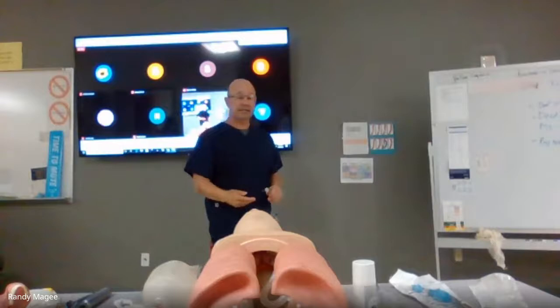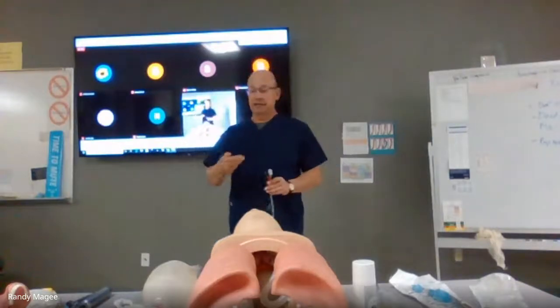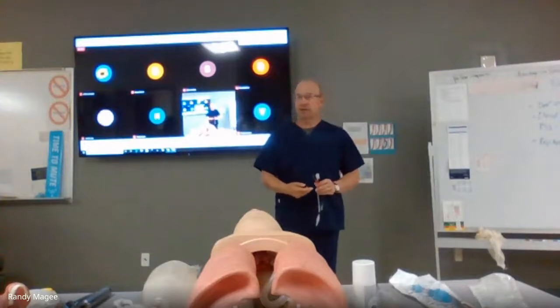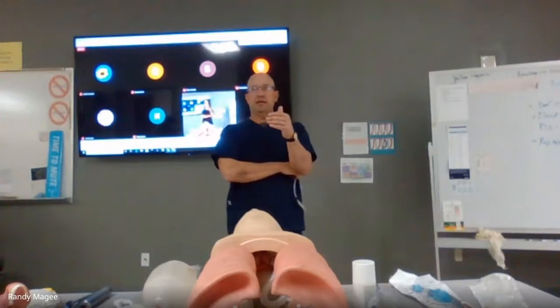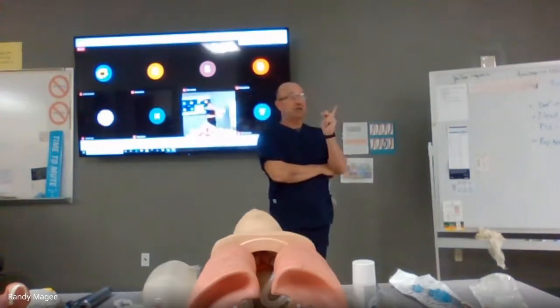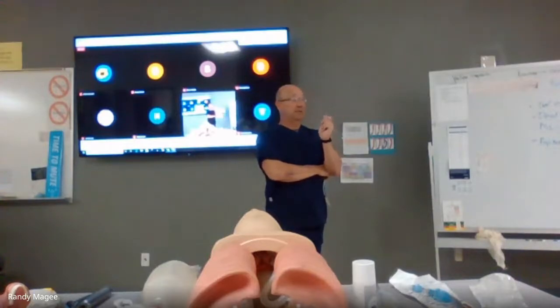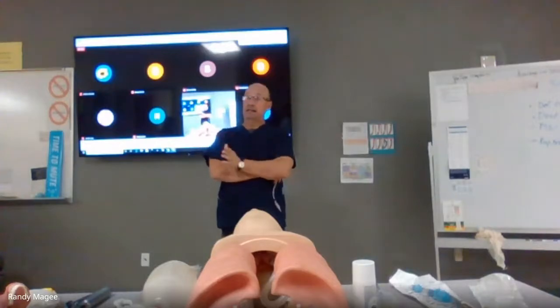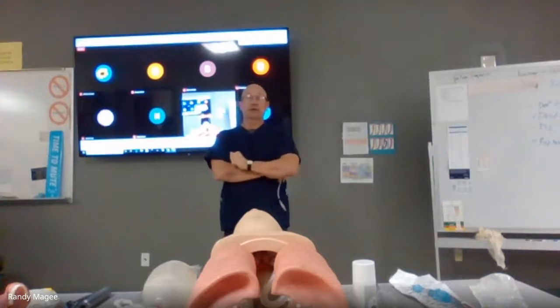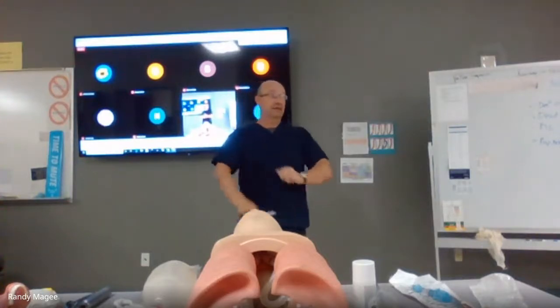If the patient is breathing, most times in either an EMS setting or a hospital setting, they do what's called a rapid sequence intubation, or an RSI. And then they give them medications. We're not going to go into the medications now, but they give them two medications. They first sedate the patient, because if they paralyze them before they sedate, then the patient knows that they're not breathing. And it's horrible. I've had patients tell me that they were intubated without the proper sedation, and they knew they couldn't breathe. That would be horrifying to know.